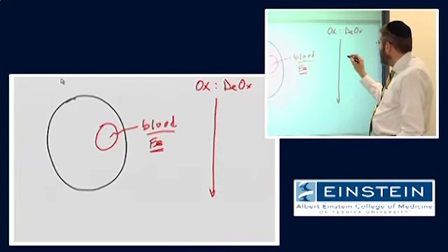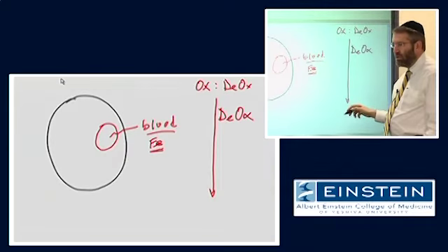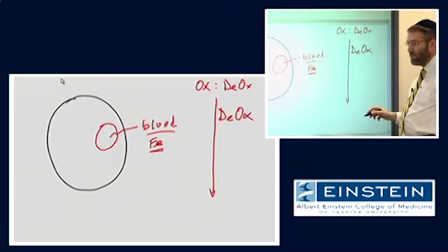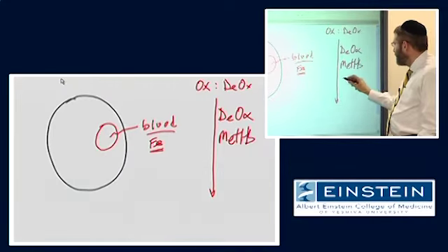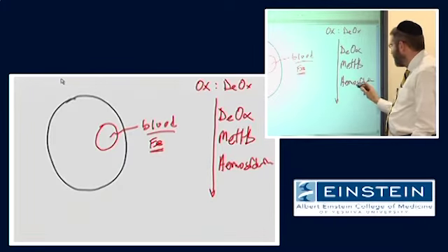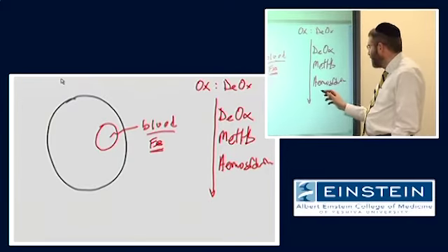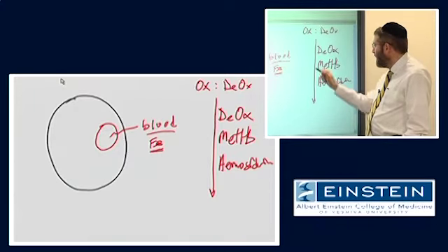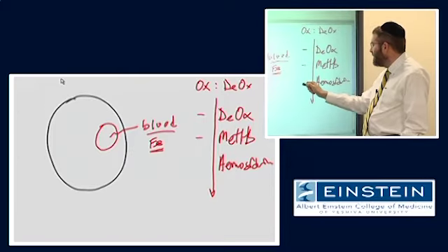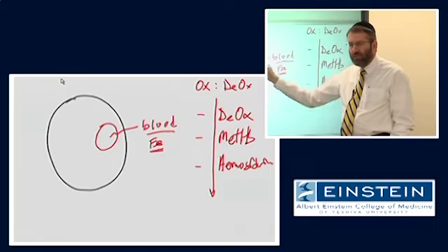And we are going to get to a point where we have predominantly deoxygenated hemoglobin. Then, as that hemoglobin molecule becomes oxidized, we'll have methemoglobin and eventually formation of hemosiderin, which gets scavenged up by inflammatory cells, right, microglia and macrophages, and stays around in the tissue in that form forever. So depending on the state in which the hemoglobin finds itself, so to speak, that's going to determine the effect over here on the image.